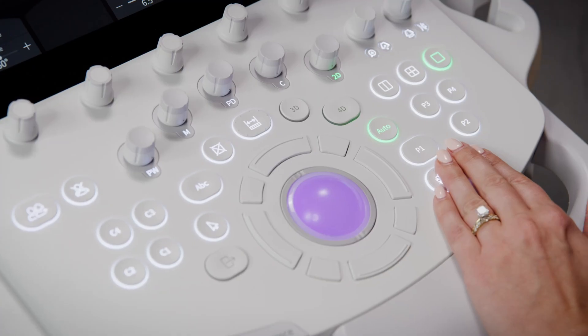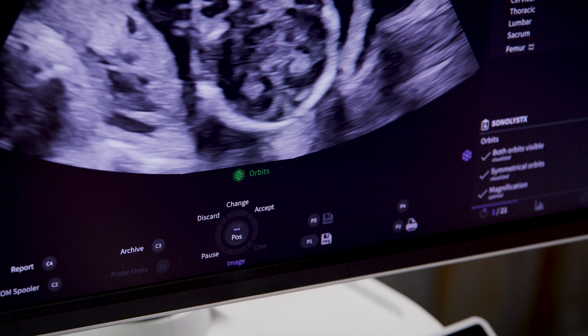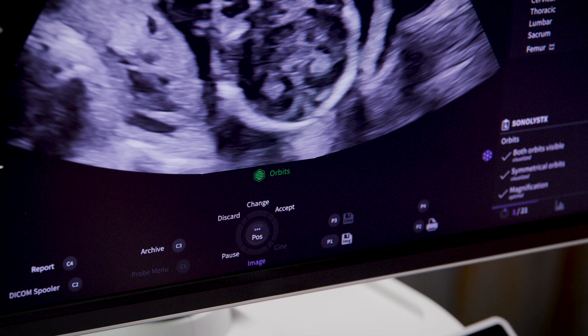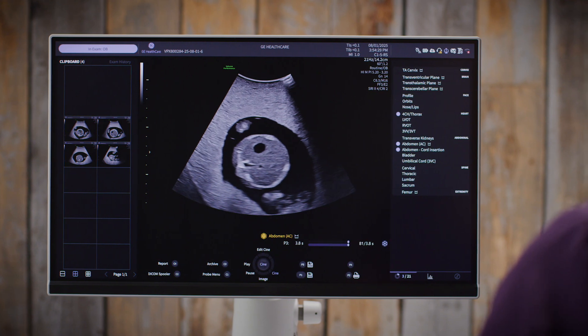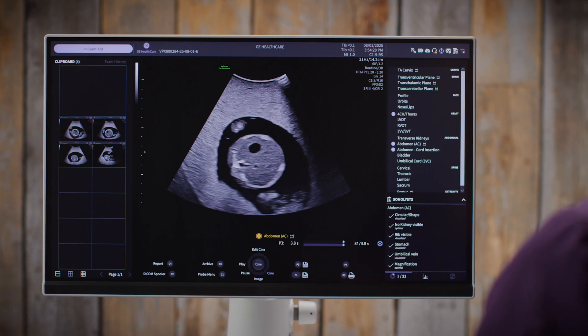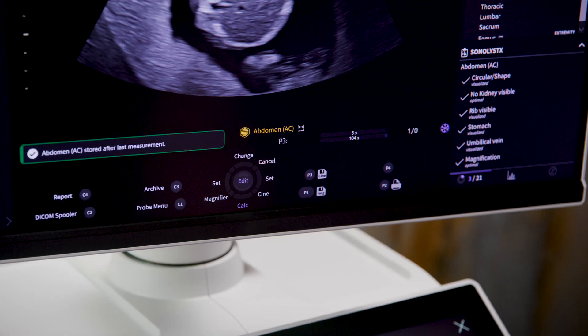Next up is manual assistance. This is perfect if you want to stay in control of when images are captured, but still want AI to help with annotating, measuring, and reducing keystrokes. Here's how it works: scan and freeze when you're ready, then press Accept using the top right trackball key or a configured P key. The system will annotate, store, and send the image based on your setup. If a measurement is tied to that view, it'll prompt you to measure and automatically select the correct one. Once you set the calipers, the image is stored. And yes, the Quiet Capture Library is still active here too.